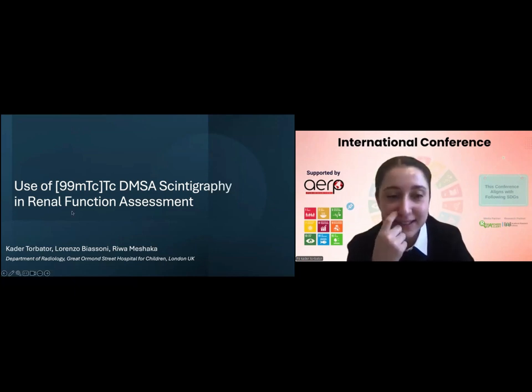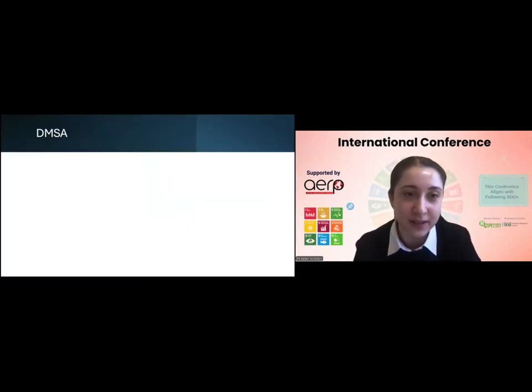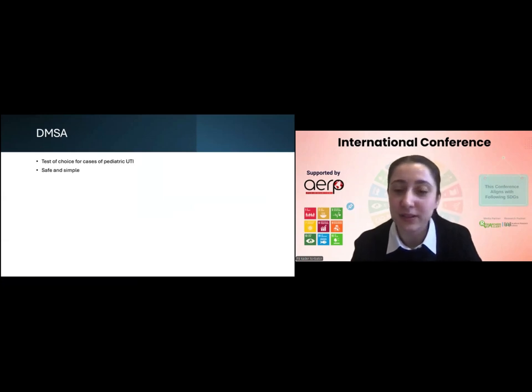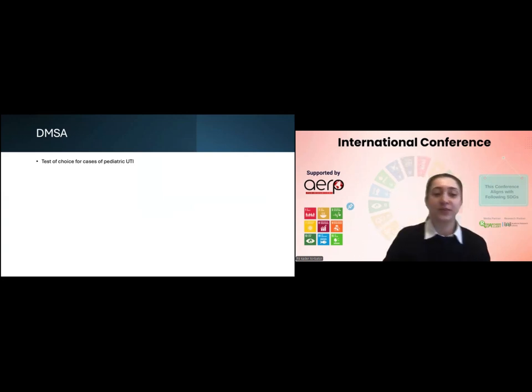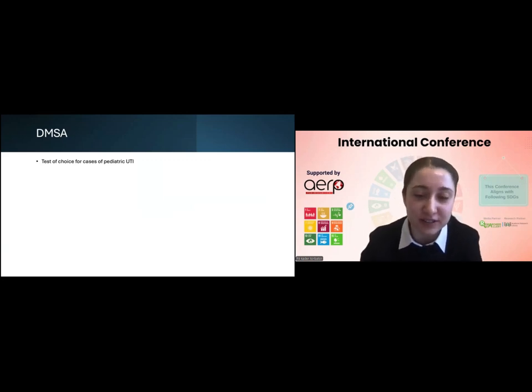I'm Kader Torbator. I will be presenting an educational presentation on the uses of DMSA scintigraphy in renal functional assessment. Just a little bit about DMSA. Essentially, within medicine, it's the test of choice for pediatric cases of atypical and recurrent urinary tract infections.